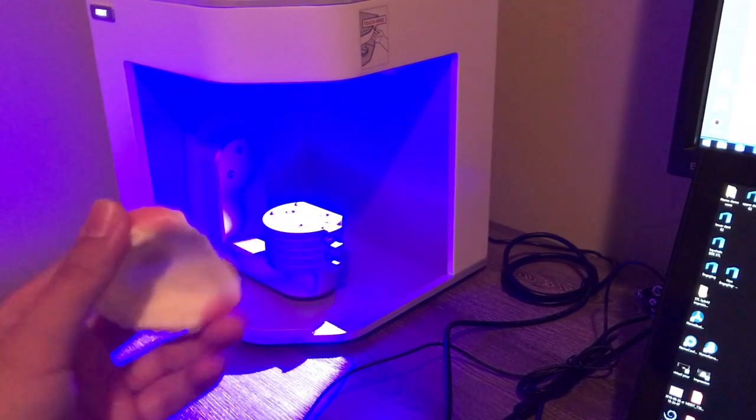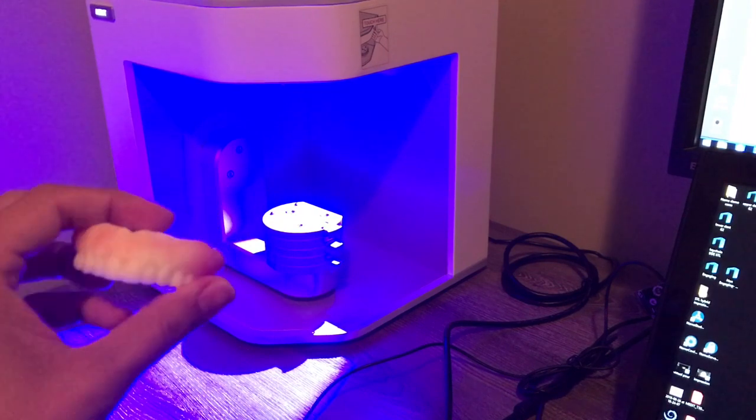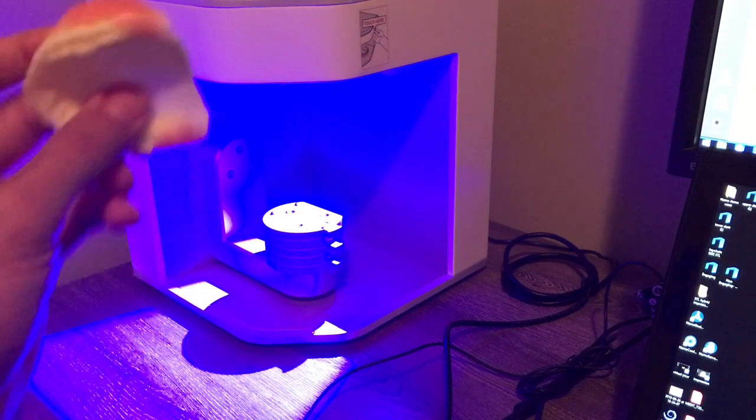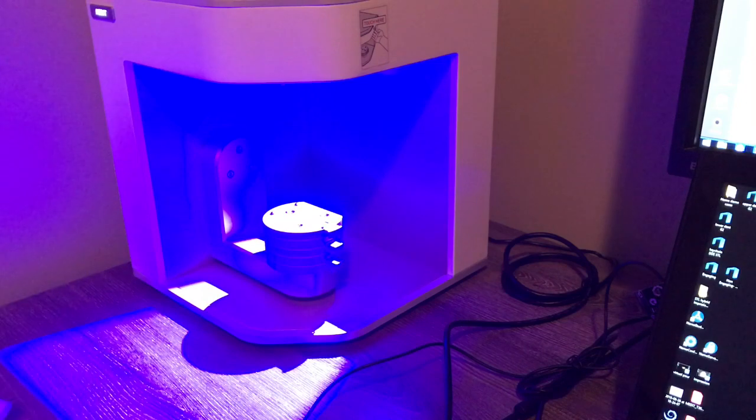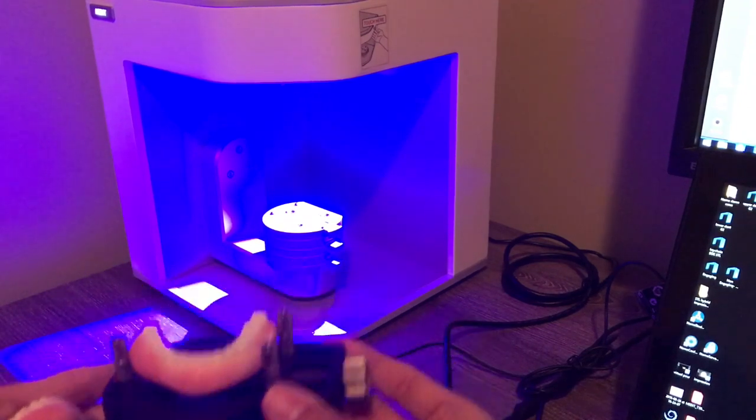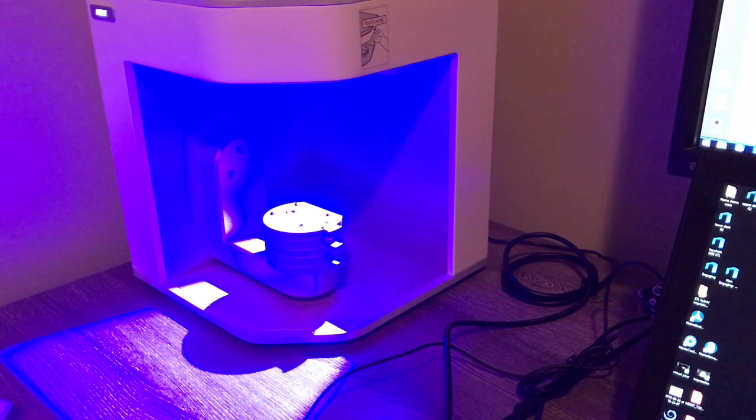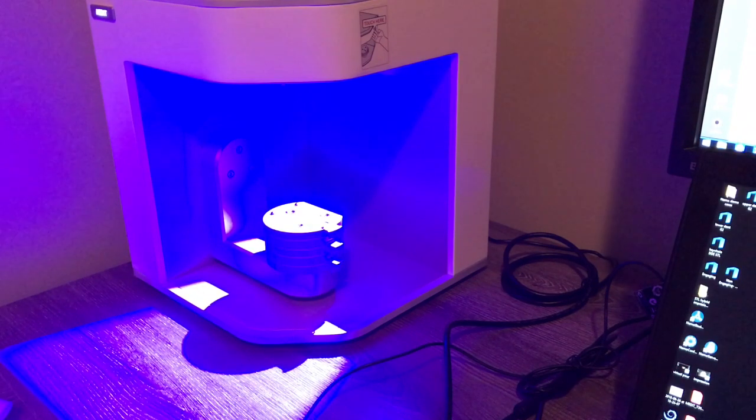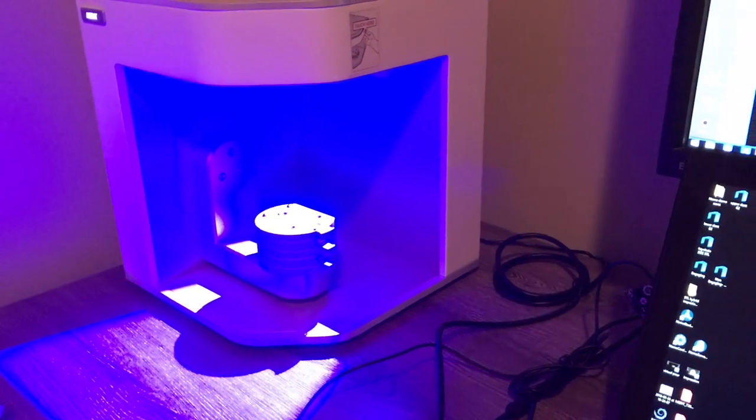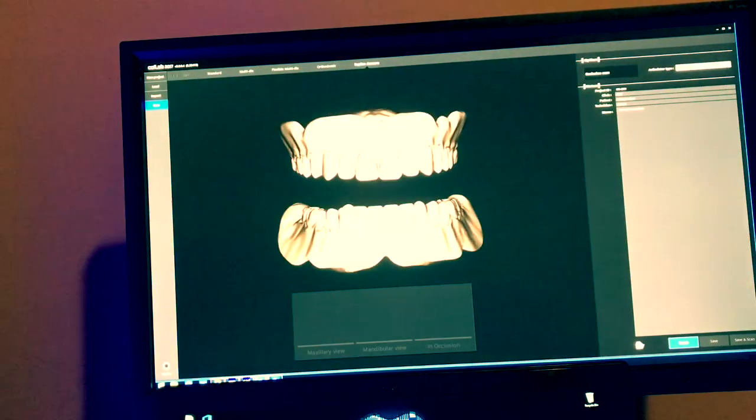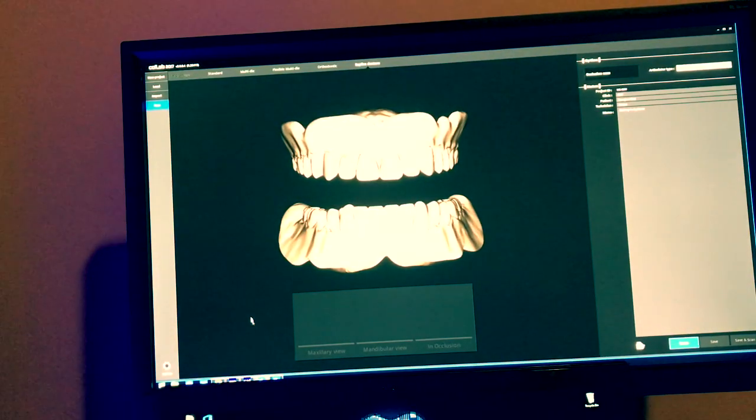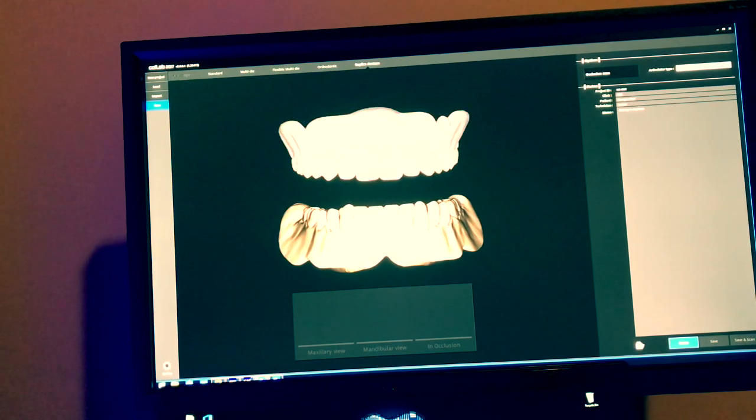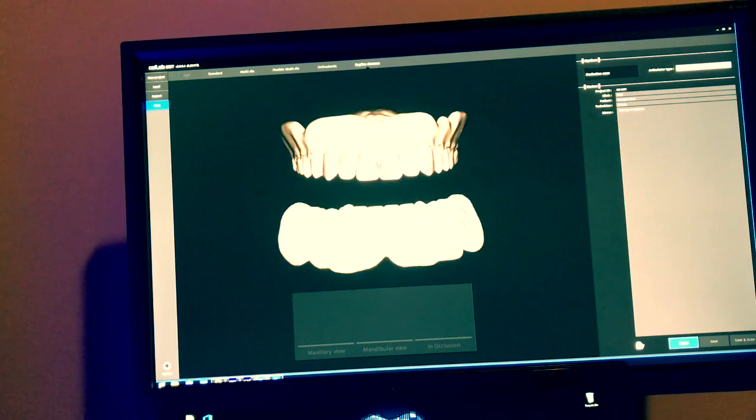I have here a printed denture of one of my patients. This is a try-in, and now what I want to do is duplicate this one and also the lower one to modify the teeth a little bit. Right now I'm in the denture replica module. You will see right here - I'm going to go back to the software called colLab and this is the module.